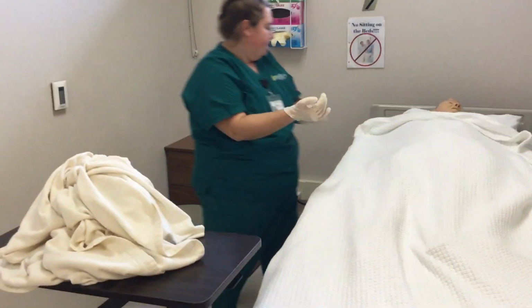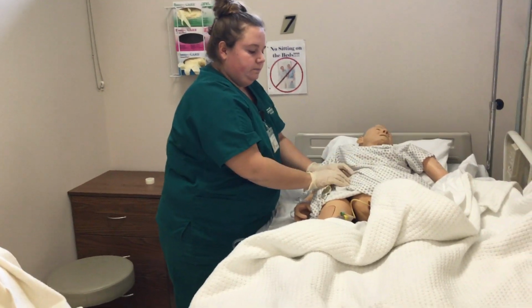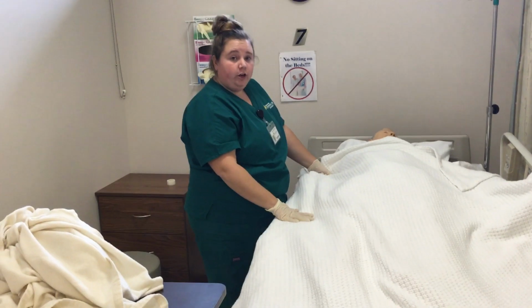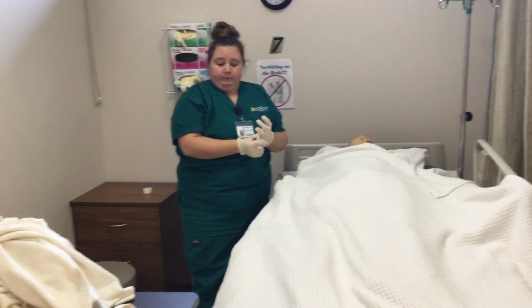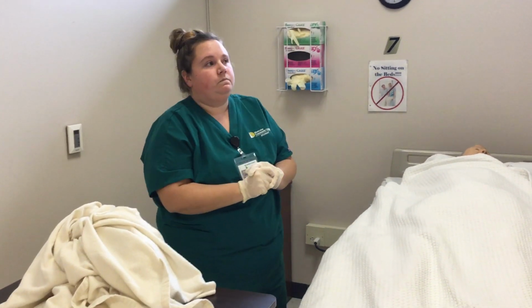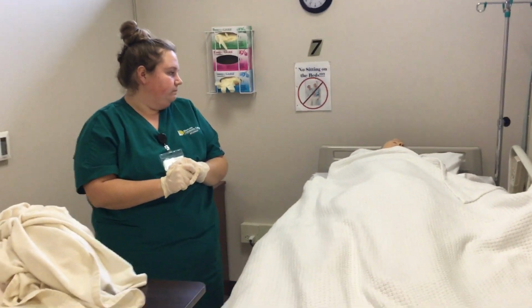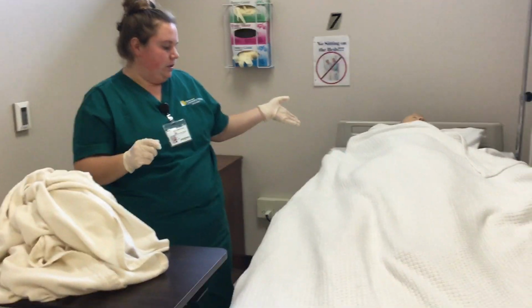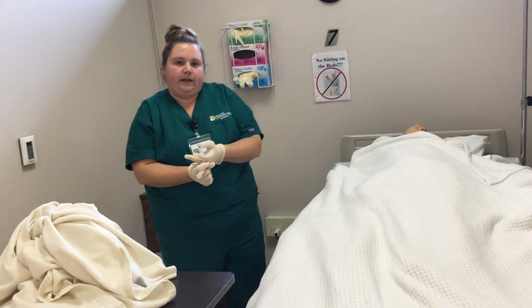I would palpate the bladder one more time for distension. And then I would ask the patient their level of comfort. I would observe the character and amount of urine in the drainage system, and I would note the character and amount in the drainage system.